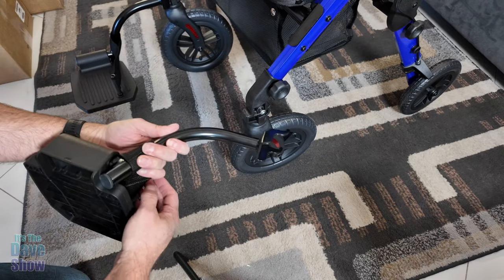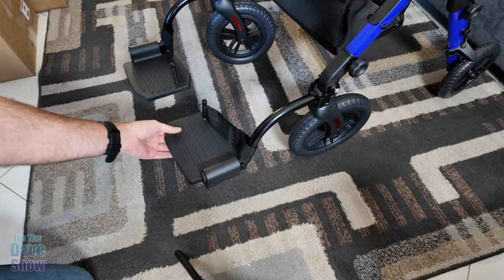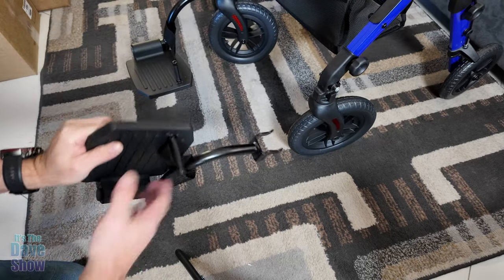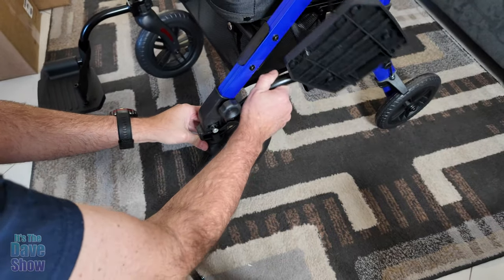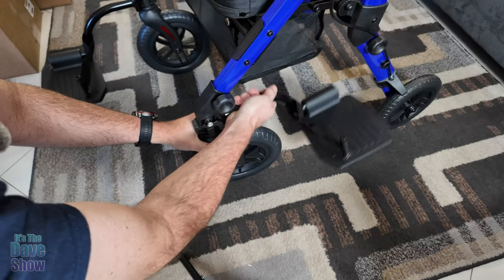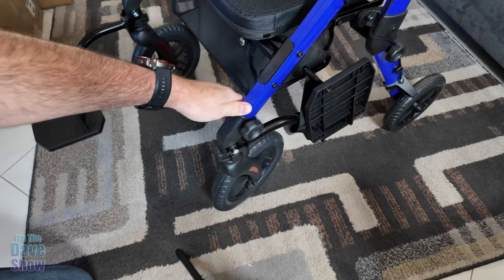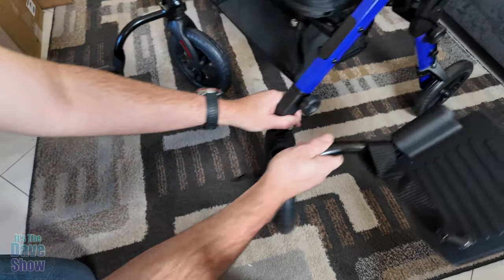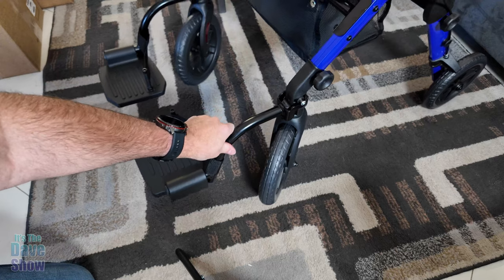Next are the foot pedals — they just clip in, super simple and easy. They can fold up if you need to, and you can take them off, no problem. You can even move them to the other side for storage. If you don't need to use them, you can keep them stored there, then flip them down and move them back to the front when needed.